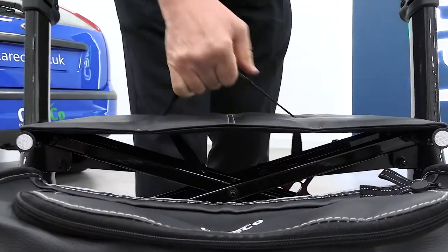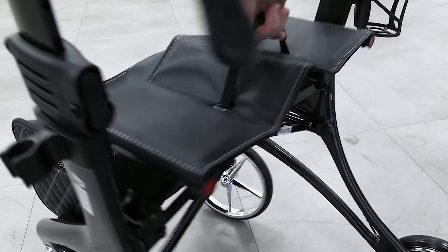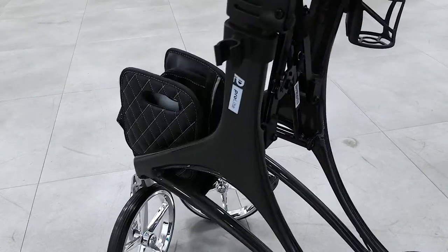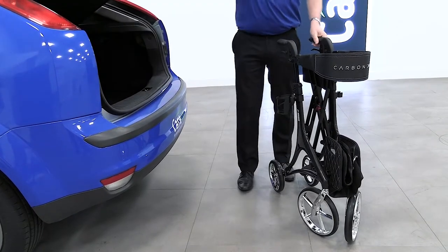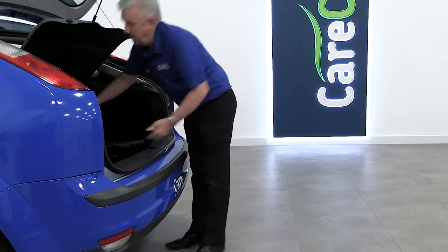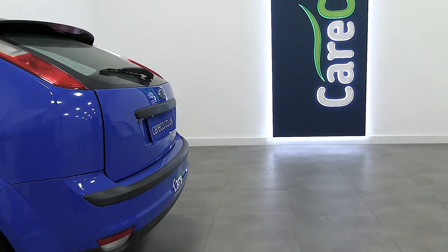The folding frame is perfect for trouble-free transportation. The Carbon X can be folded with just one hand using the pull handle on the seat. The collapsible design allows you to reduce the amount of space the rollator takes up in a car boot. With a carry weight of just 6.6 kilos, it can be lifted in and out of storage easily.